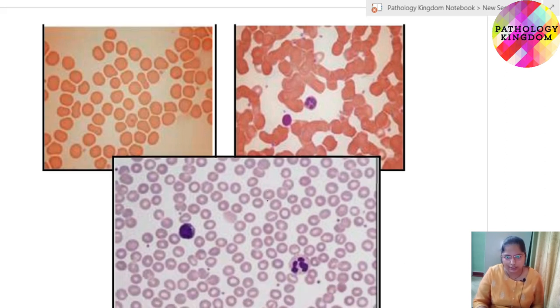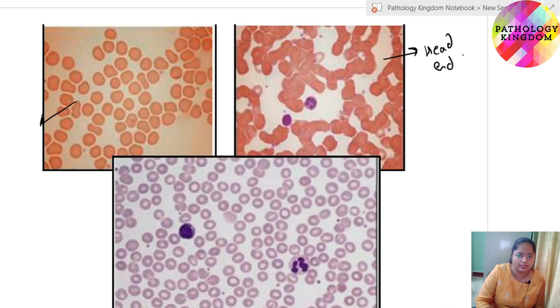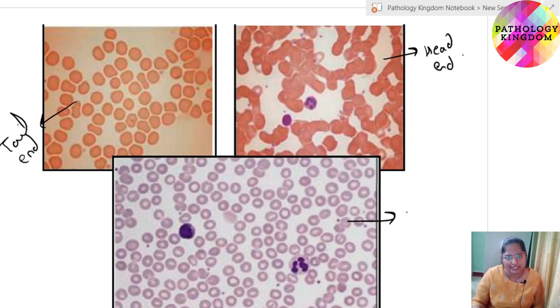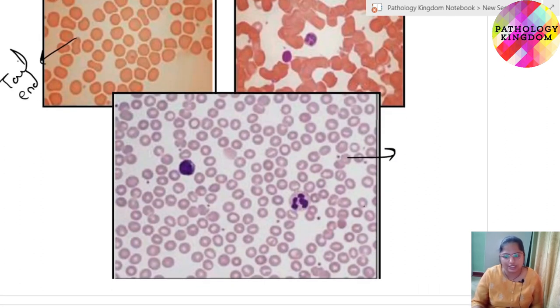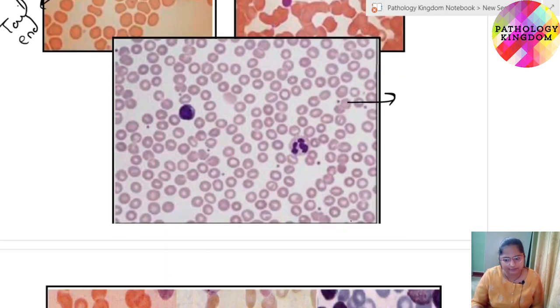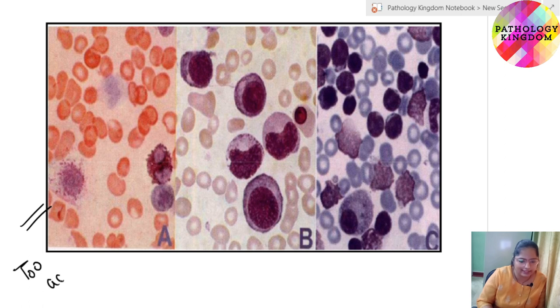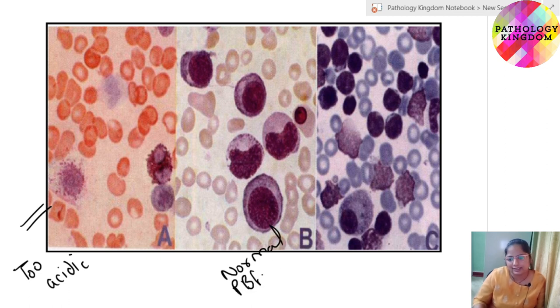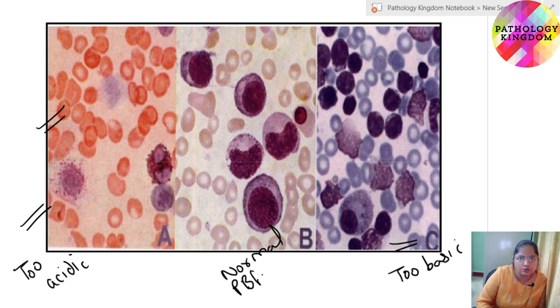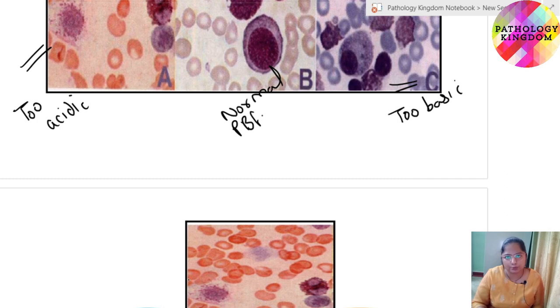These are the slides again showing the area of examination. Now, these are PBFs showing staining issues: the first one shows the stain is too acidic, this is the normal stained PBF, and in this one the stain is too basic. You get a bluish picture if the stain is too basic and a pinkish picture if the stain is too acidic, which will lead to inappropriate reporting.